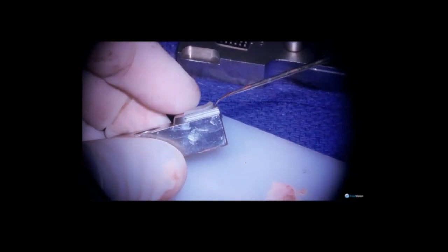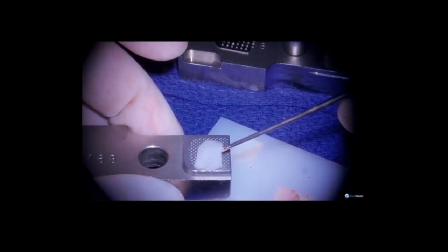Using this method, you can usually get two nice thin pieces of cartilage to choose from, or sometimes use them both if necessary.